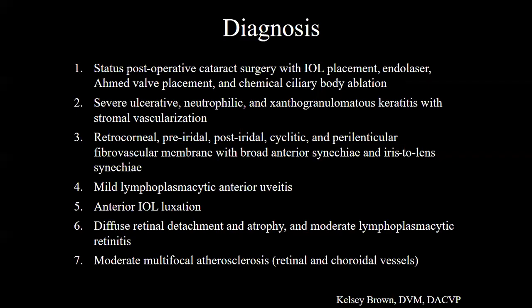There was a somewhat recent case series that came out of Colorado describing these surface ocular xanthogranulomas, and a large subset of them didn't have any serum lipid derangements, which is interesting. In this particular case, this is a dog that has diabetes mellitus and hyperadrenocorticism and evidence of atherosclerosis. So I suspect some sort of serum lipid derangement was in play here for this particular case.